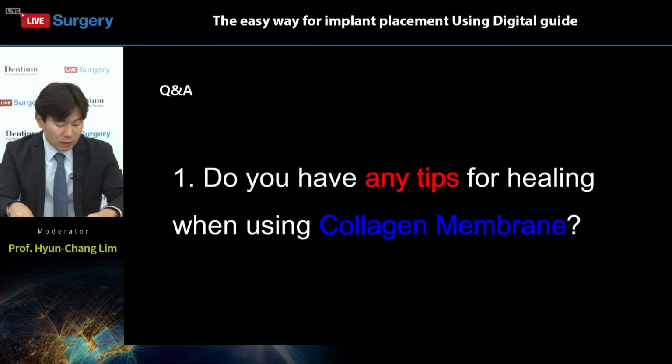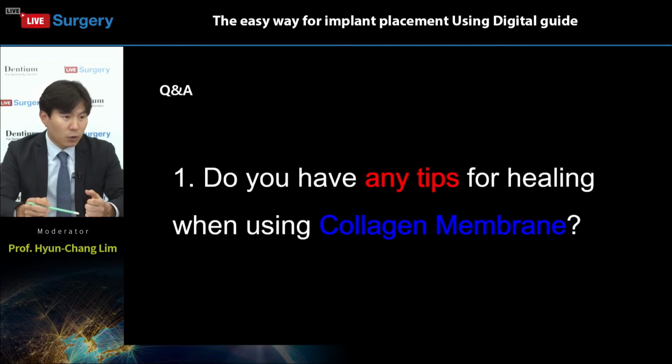Yes, I think it's time to sum up the case. Today, we have an old patient with several systemic disease. And this kind of patient needs the minimal trauma and reduce the surgical time. That's why Dr. Park used the surgical guide. And for the minor bone defect, GBR with non-submerged type healing can be applied.